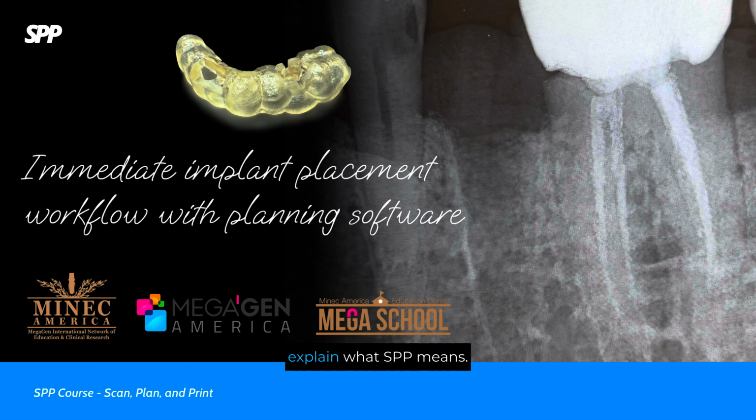First, let me briefly explain what SPP means. SPP stands for Scan, Plan, and Print. This course covers the key elements of digital dentistry. We will talk about CBCT scanners, intraoral scanners, and facial scanners. We will also cover surgical guide fabrication, digital treatment planning with R2 gate, and 3D printing for prosthetic restorations.